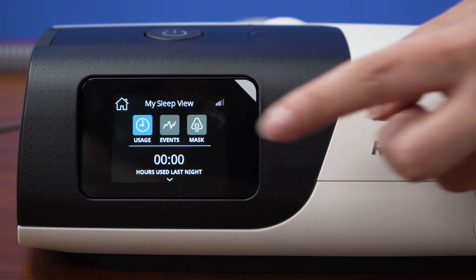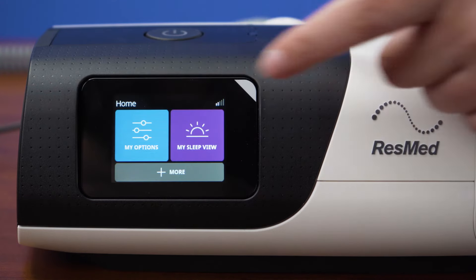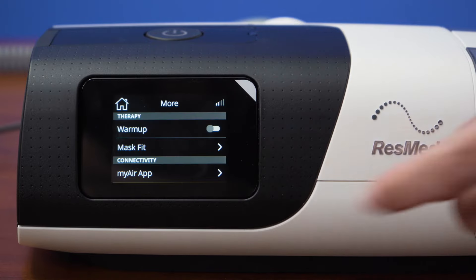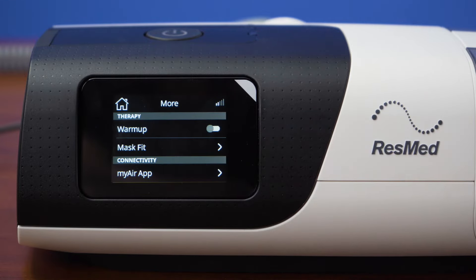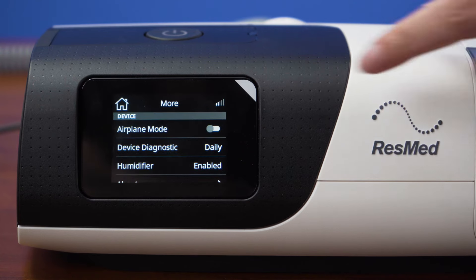If you tap on the sleep view tab, you will see your usage and mask fit from the previous night or session you last wore the device. The more tab is where you can choose to have the humidifier warm up or preheat before you use the machine — it usually takes 30 minutes to warm up. Here you can also run a mask fit test.